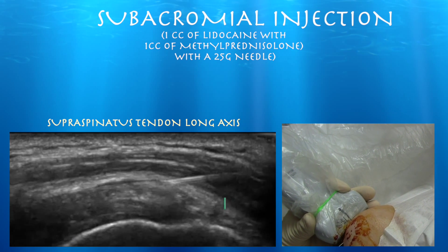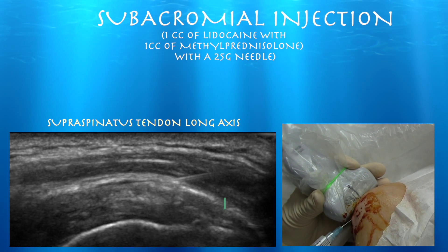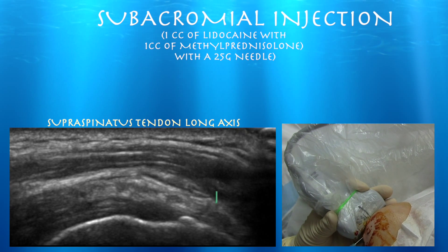Here you can see we're injecting and filling up the subdeltoid bursa with the injectate. You can see how it's separating those two planes of the deltoid muscle and the subdeltoid bursa. Then you can actually advance the needle proximally.